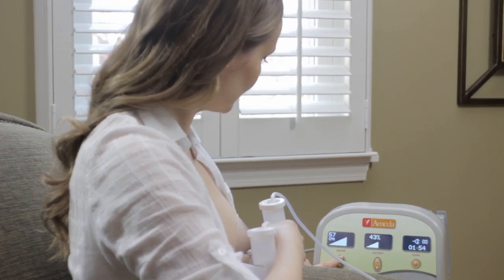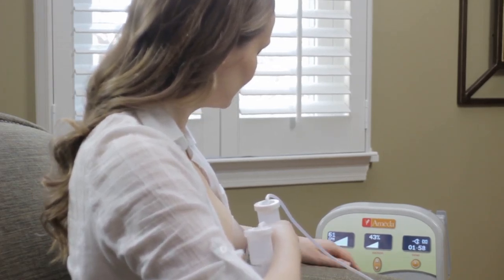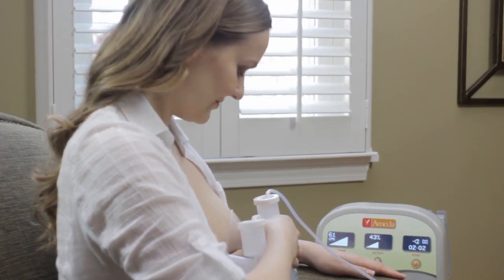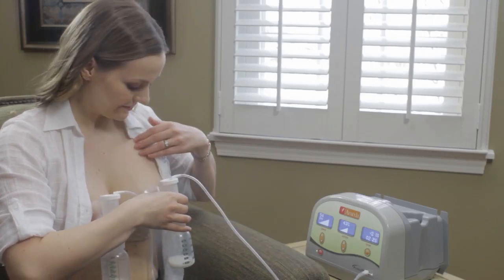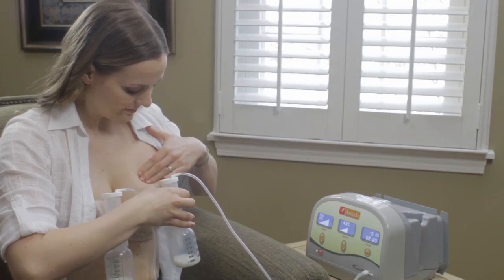These suggestions are just a starting point. Always use the pump settings that work best for you. To trigger a milk release, it may also help to gently massage your breasts or apply a warm compress.